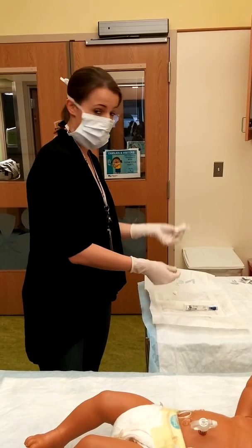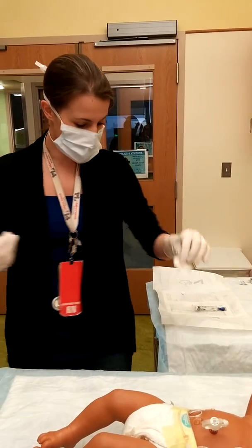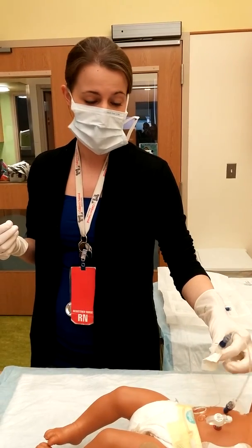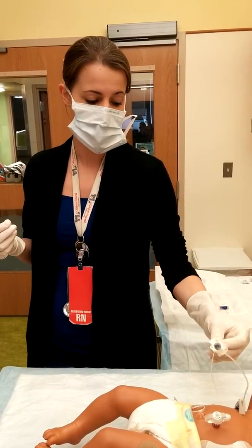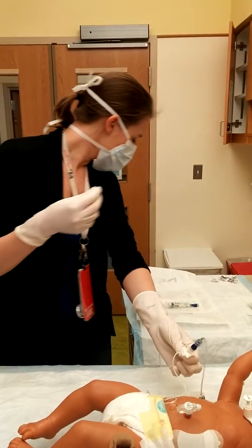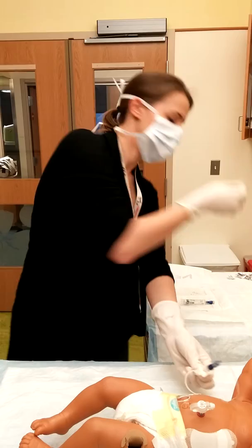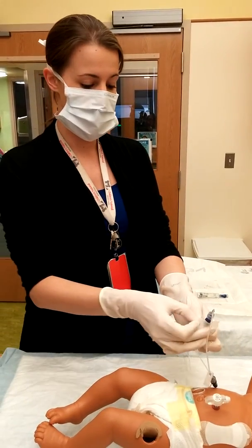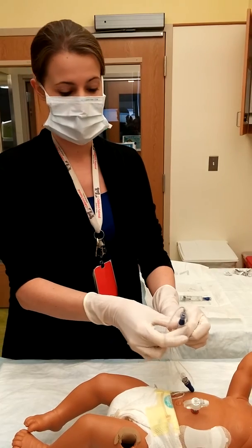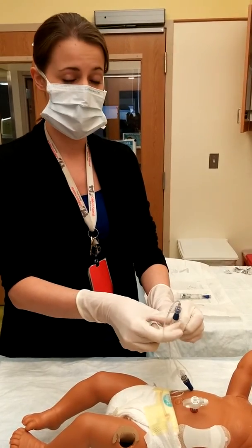Then, with your non-dominant hand, take your gauze and pick up your line. If it's a UV, you might want to pinch at the line so that no air can come back — just hold your hands like that. Then you'll take one of your chlorhexidine wipes and scrub the site where the cap and the catheter meet for 30 seconds, using good friction.